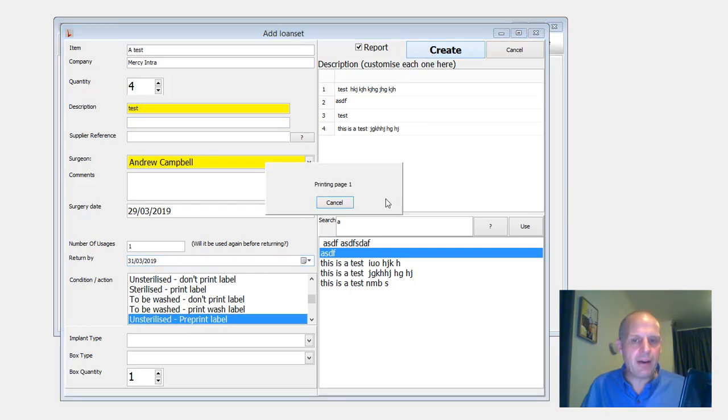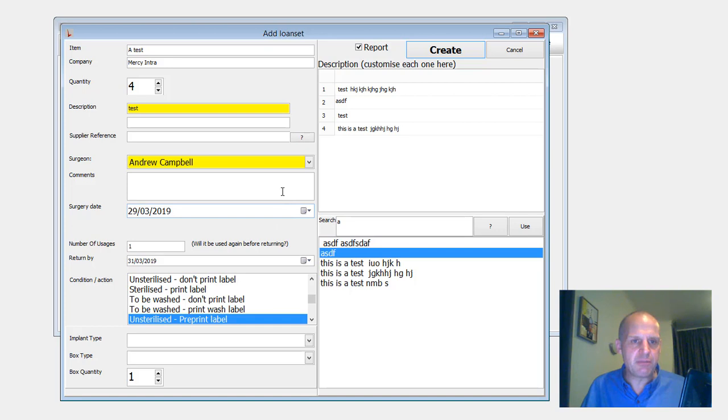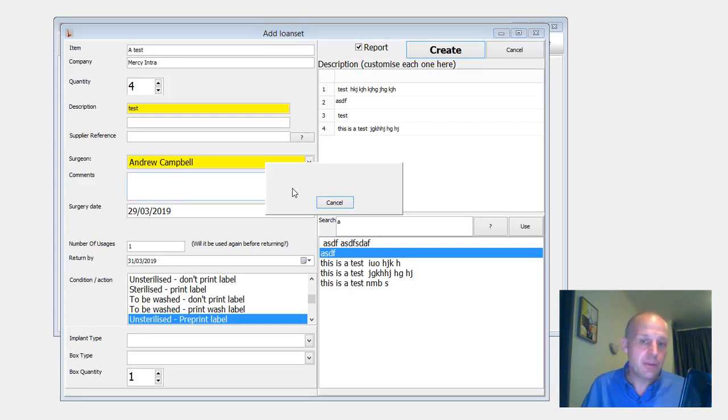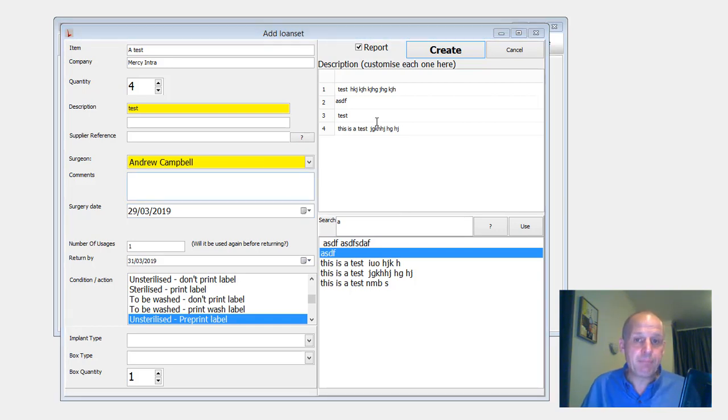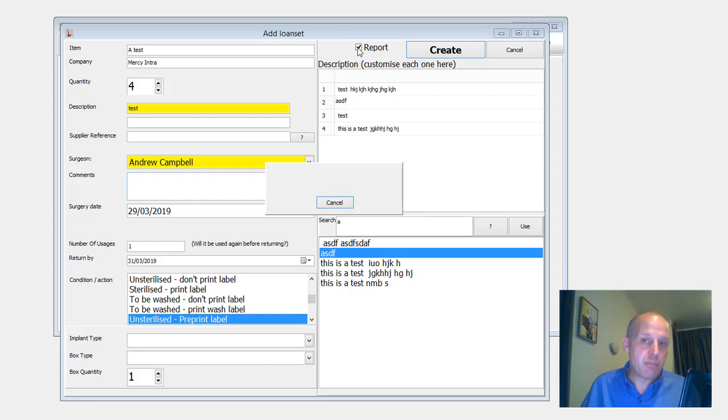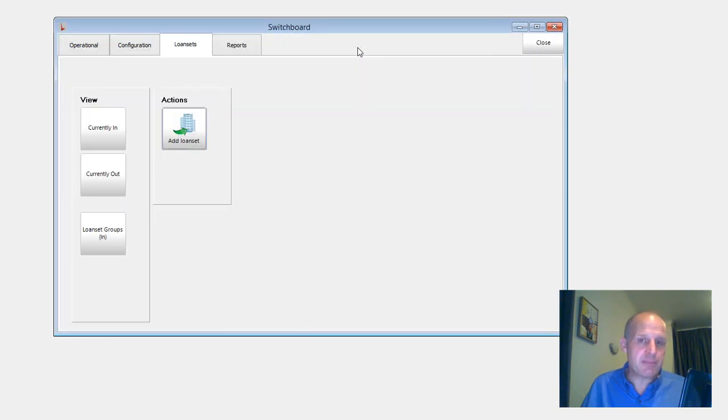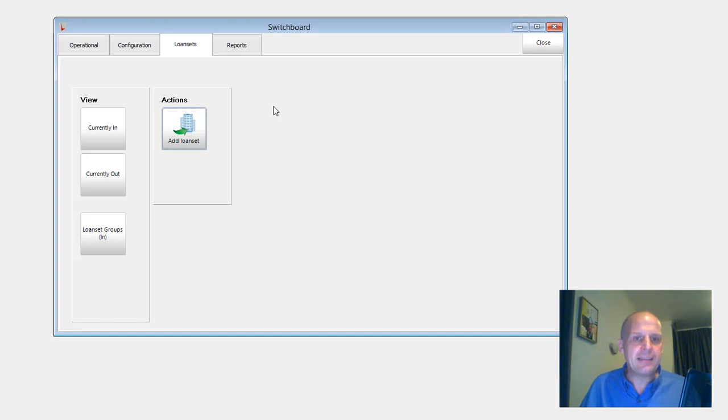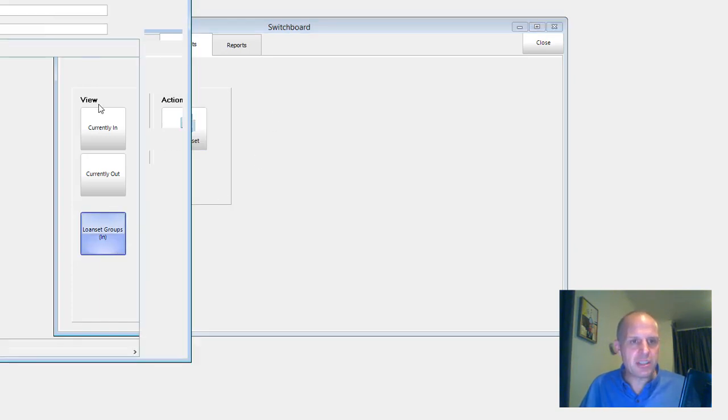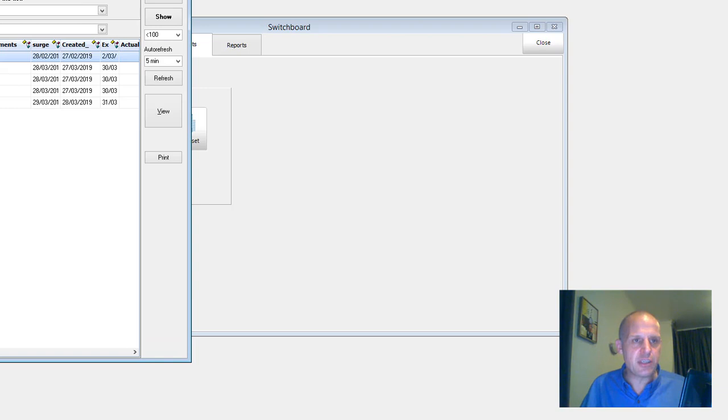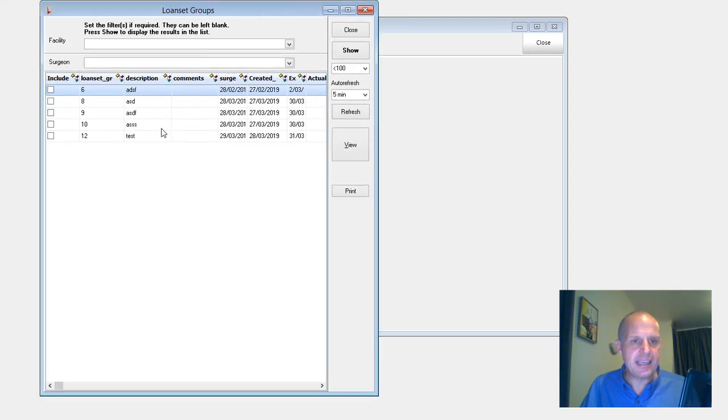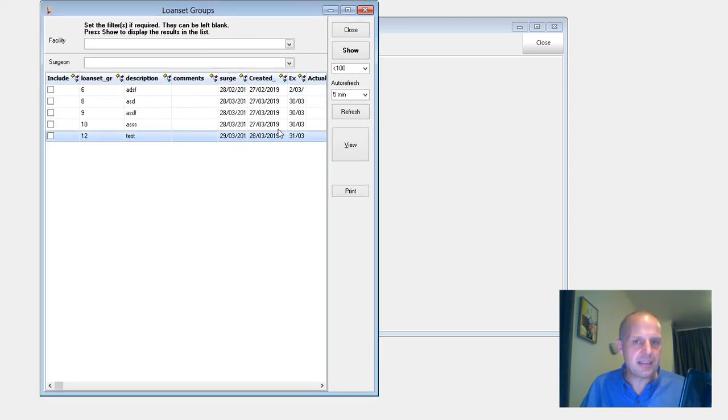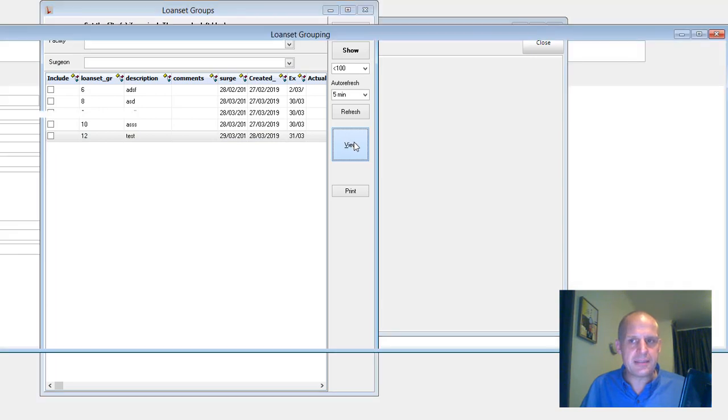And you hit create. And now I'm off merrily printing for labels. Two, three, four. There's a report as well that's been printed, which will list those items. And that's it. But now I've got these loan set groups in. I'll just go here. This is showing me all the loan sets that are currently in the area. Here's the one that I've just done. Let's view it.